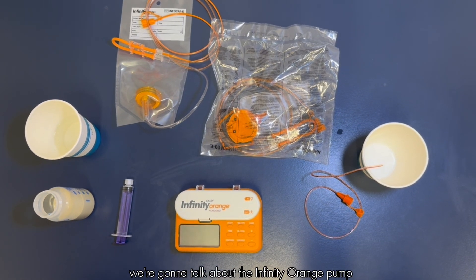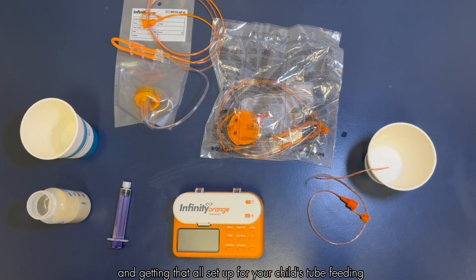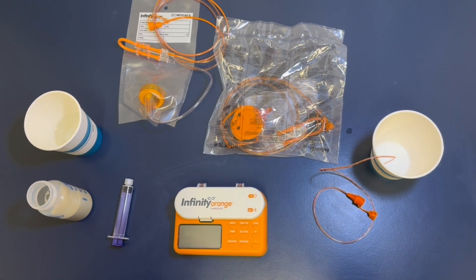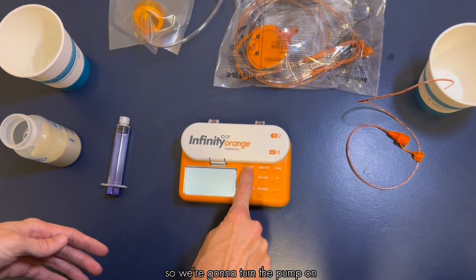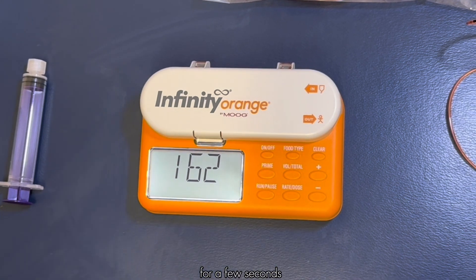We're going to talk about the Infinity Orange pump and getting that all set up for your child's tube feeding. The first thing I like to do is program the settings. We're going to turn the pump on by pressing and holding the on-off button for a few seconds.